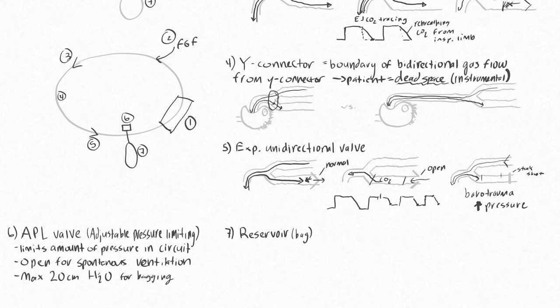Beyond that, you have a much higher chance of gastric insufflation because you've essentially broken the seal of the lower esophageal sphincter. That being said, if you are having difficulty bagging a patient, it makes sense to set this much higher because your primary concern is actually delivering air or oxygen to the patient down here. Draw them in here. Here's a mask right now, but it could be an endotracheal tube. And then setting this APL valve to something higher, maybe 50 or 70, would ensure that all of the pressure is going towards the patient rather than being vented off through the APL valve.